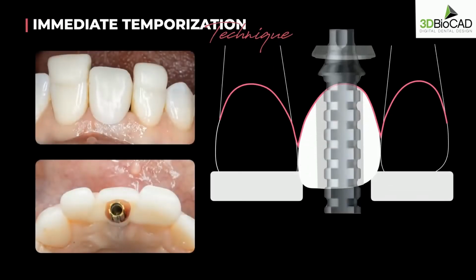And the next step is to seat the shell temporary with a positioning jig. Now, when you do this, the temporary abutment might be touching the temporary shell. So one option is to adjust the temporary abutment, and the other option is to adjust the temporary shell. So what I like to do is adjust the temporary shell because it's much easier to grind acrylic than to grind metal.